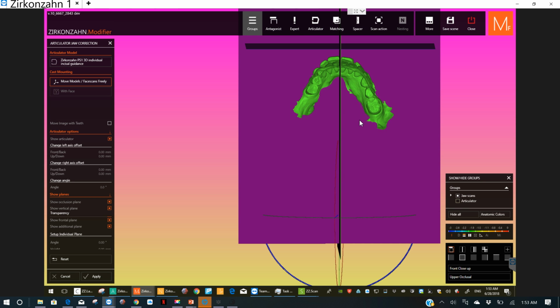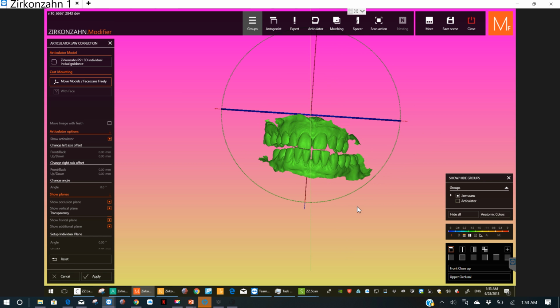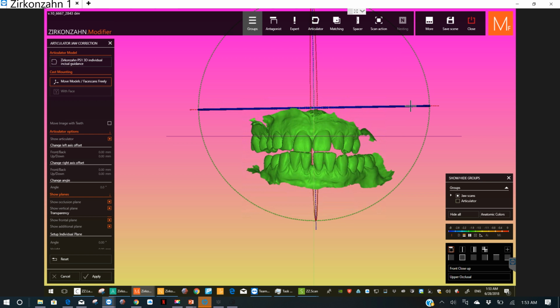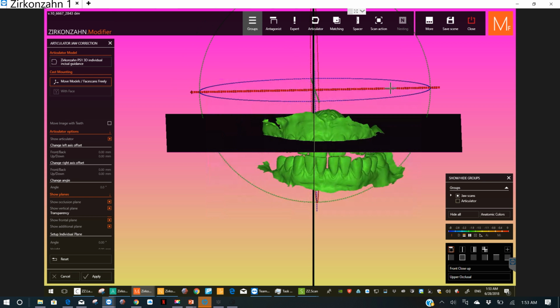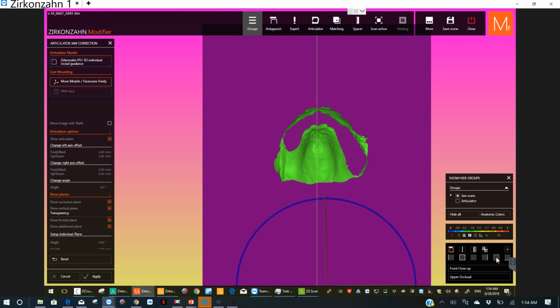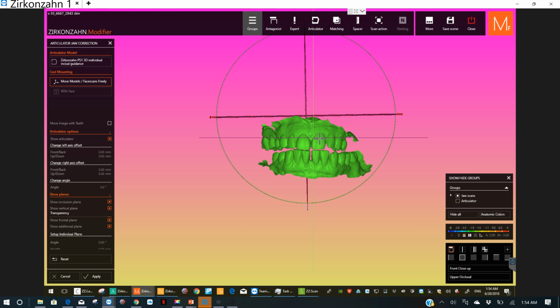Okay. I don't know what that plane does. I'm going to get rid of that one. So it twisted right there because I didn't grab that red bar, which slides it back and forth. I accidentally grabbed the wheel, which turns it. So I'm going to use the wheel right now and make sure that this thing isn't yawed, and it is a little bit, so it's hard to tell when I'm not straight up and down. Gotta grab that red line so you can slide it. And kind of annoying.